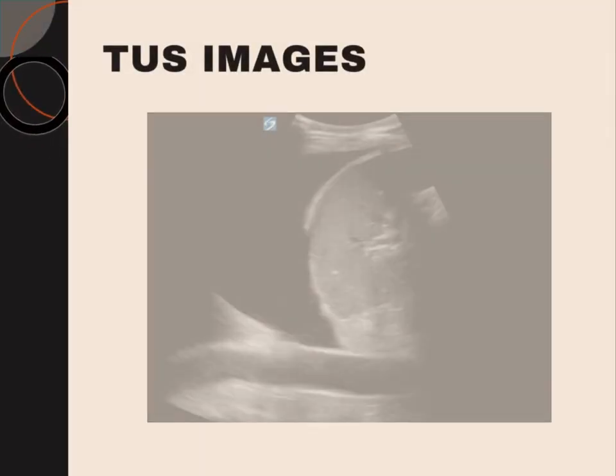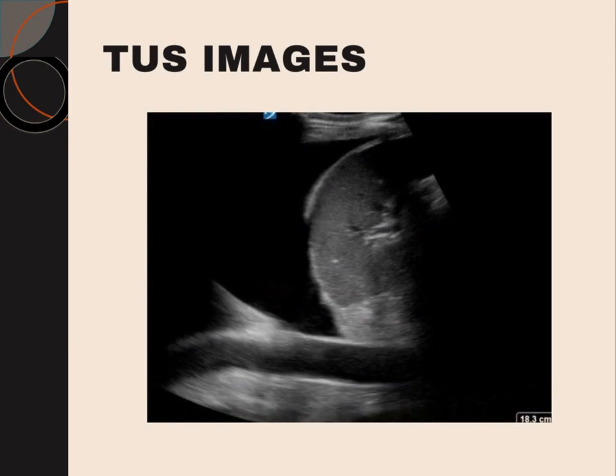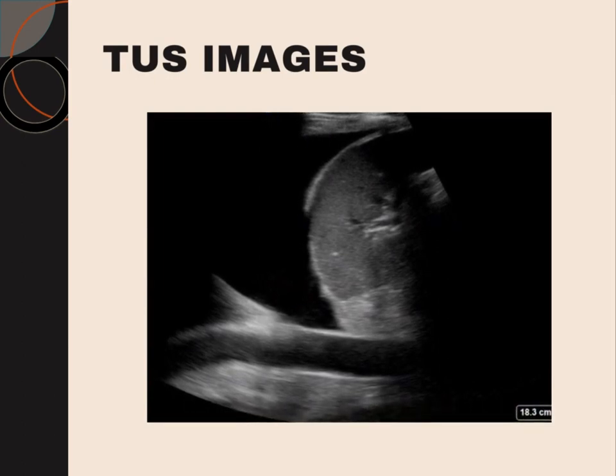So I've just added some ultrasound images to get an idea. You can just look at how we are putting a probe on. This one, where the mouse is at the moment, is a pleural effusion. The anechoic or hypoechoic shadowing over here is like a black shadow you will find. Skin is on top along with the pleura, and the lower surface would be the lung.